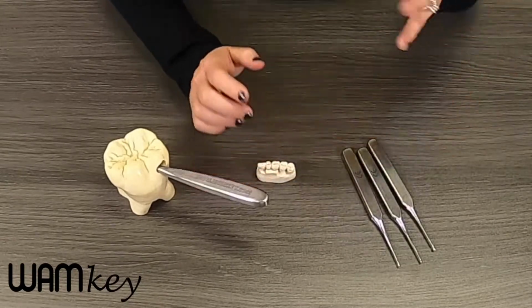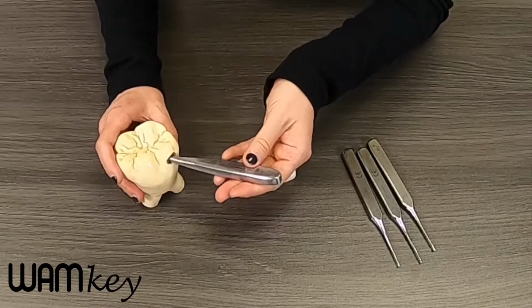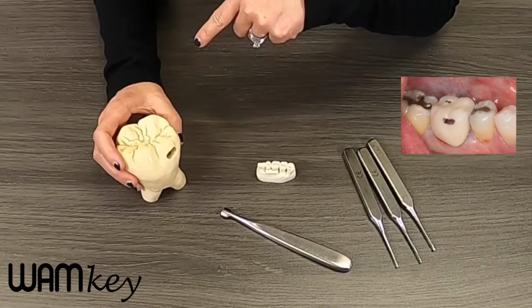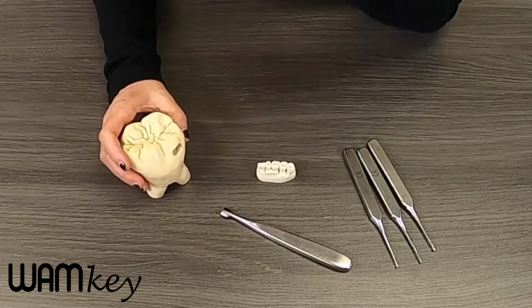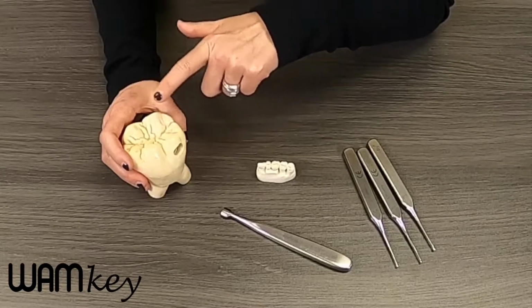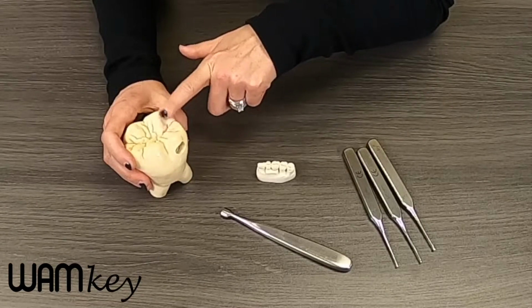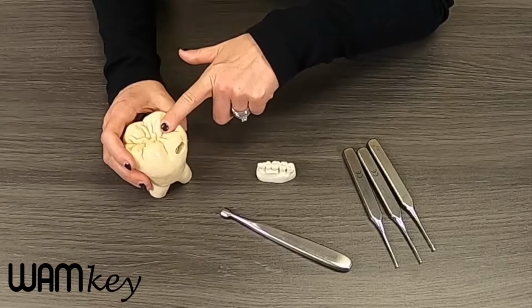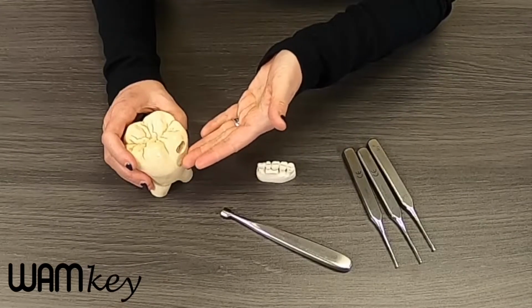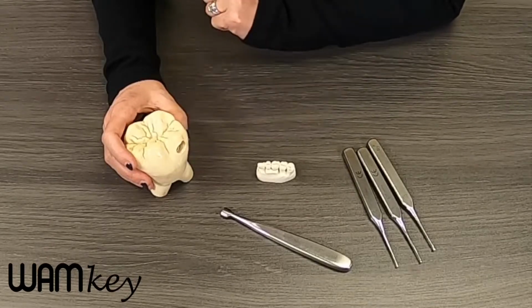So basically with this instrument, how it works is you need to find the cement junction of where that tooth is cemented on. It's a little bit challenging sometimes, but we always recommend to base it on what type of crown that you are using. If it's a PFM crown or a gold crown or a stainless steel crown, that would determine how far down you go. Usually we stay in the occlusal 1/3.